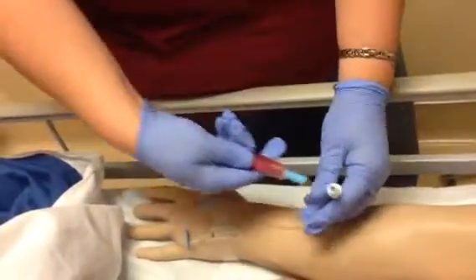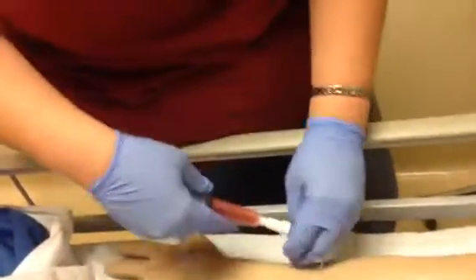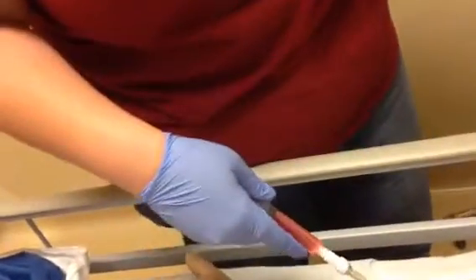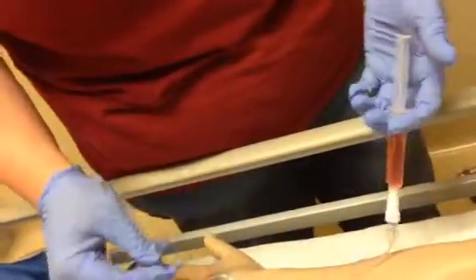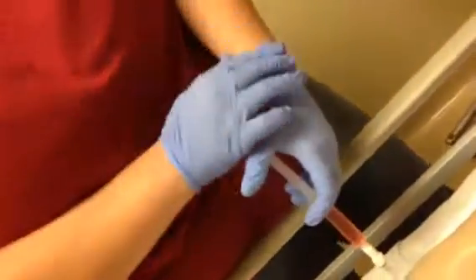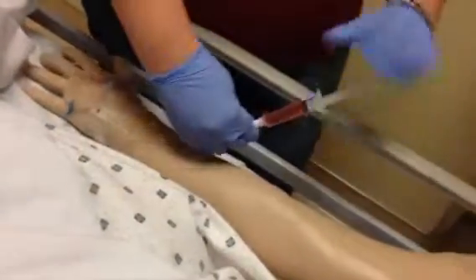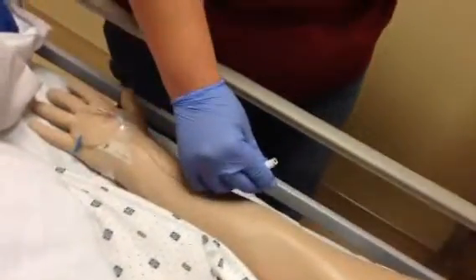Then I'm going to take my medication. Okay. And then remember, we looked it up in our drug book and we saw that we needed to push this over 3 to 5 minutes. So you would want to get your watch and push this medication in slowly over 3 to 5 minutes. So you give your medicine. Okay, once you give your medicine, you would disconnect.